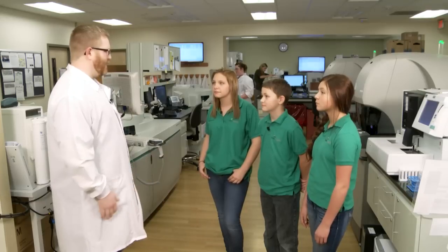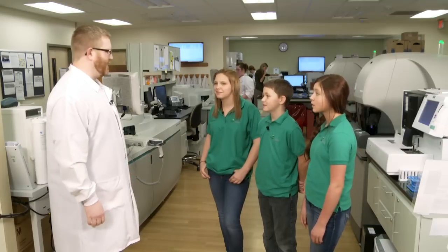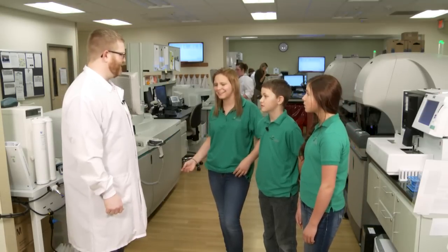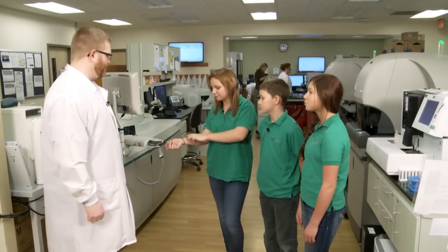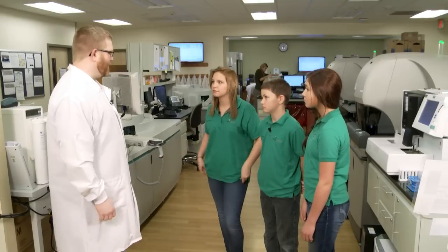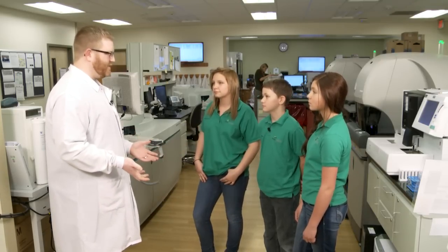Have any of you ever had blood collected before — had your blood drawn? And how do they get the blood out of you? What do we have to use to do that? They take a needle and they put it in one of these veins. That's right — you put a needle in your vein and the blood comes out into different types of tubes.